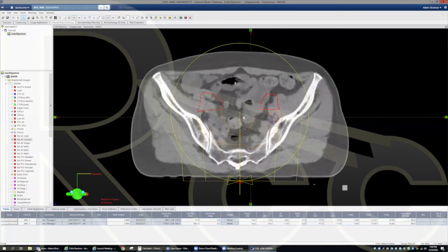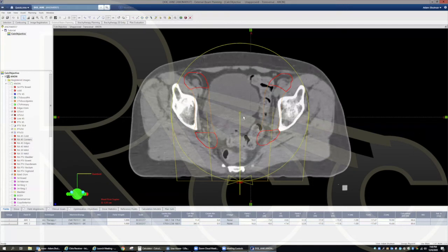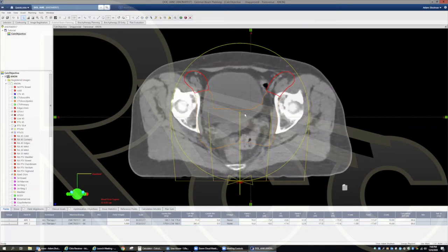Not really, in my experience. That has some other areas of impact in terms of deliverability and DLG and that sort of stuff. But in terms of the optimizer working, I haven't seen that as a factor.